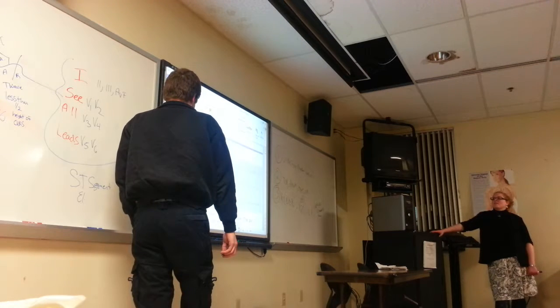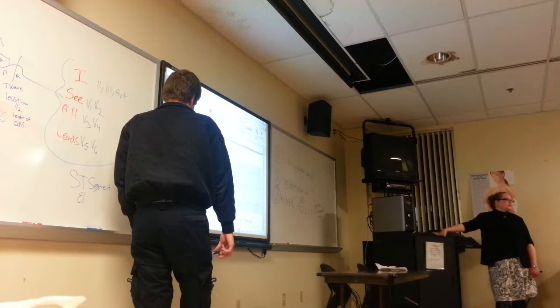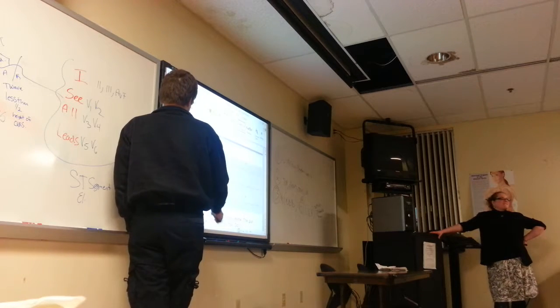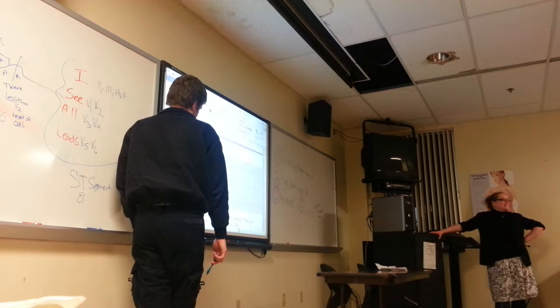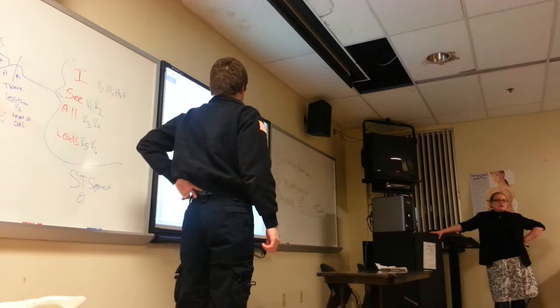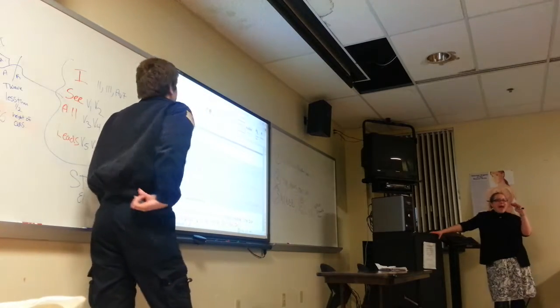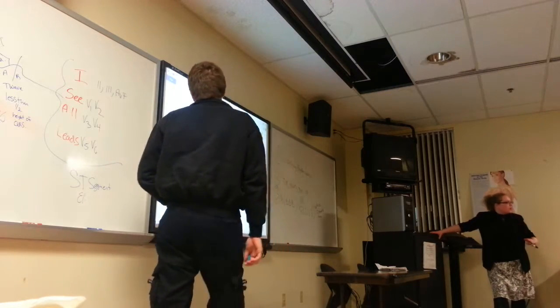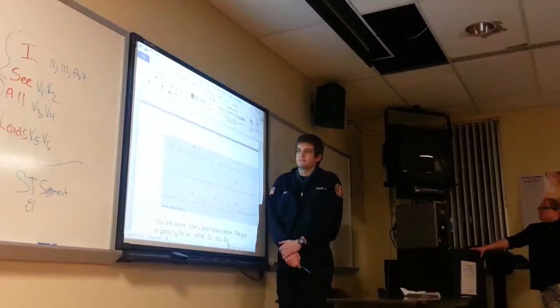All right. So look at lead 3. Now we're starting to have some issues here, because what do you see in lead 3, guys? Depression. Yeah. I totally see ST segment depression in this. And what makes it ST segment depression, guys? Because it starts below the isoelectric line. Do you guys see that? If it was inverted, it would start at or above the isoelectric line and dip below. But this doesn't, it starts below. Okay? All right, let's move on to AVR.